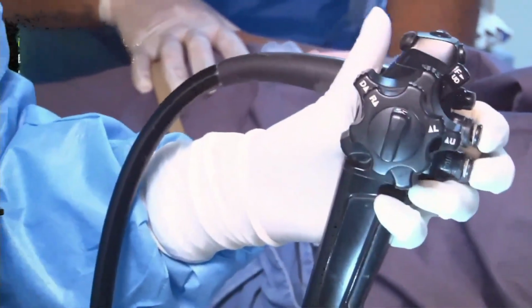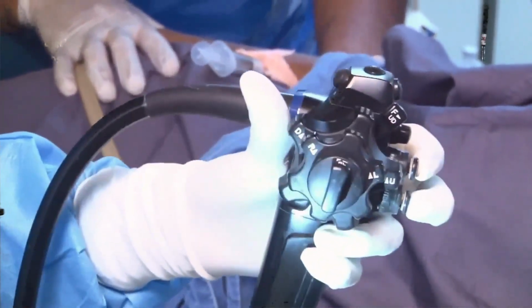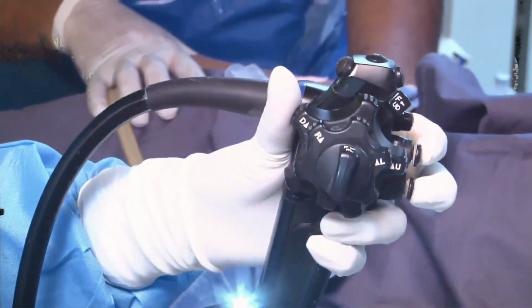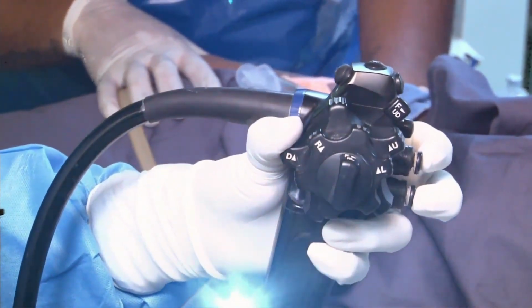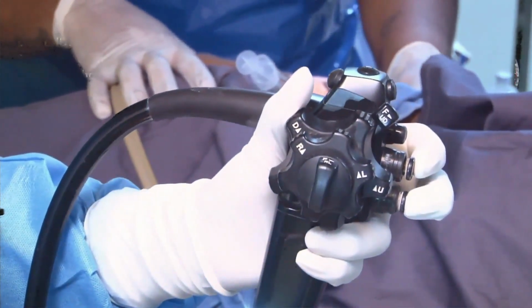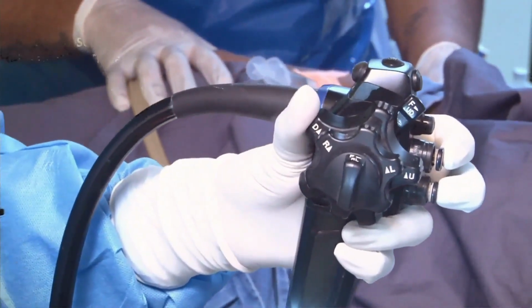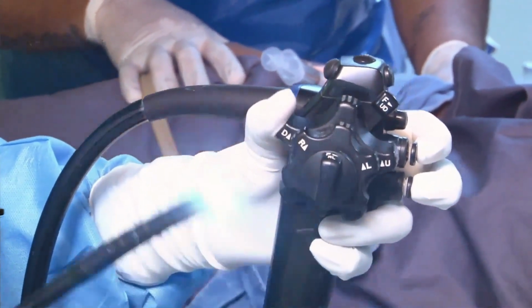The most important wheel for the beginner is the big wheel. All the movements you can accomplish by a simple single movement, that is big wheel towards you. That's all. If you don't want that amount, you can always make it away from you. It will correct itself. Otherwise, most of the turnings and movements are done with a big wheel towards me. That's the one thing you understand.